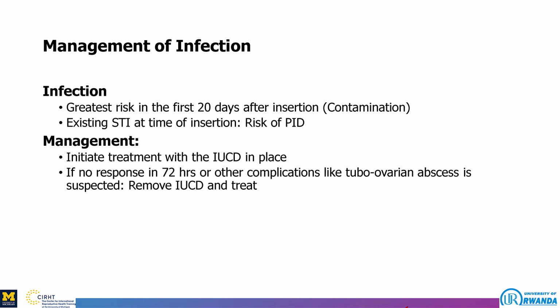It may be due to using unsterile procedures or techniques of insertion. Or maybe the woman already has a sexually transmitted infection before the insertion, or maybe she has pelvic inflammatory disease before the insertion. That will increase the incidence of her developing infection after the insertion.